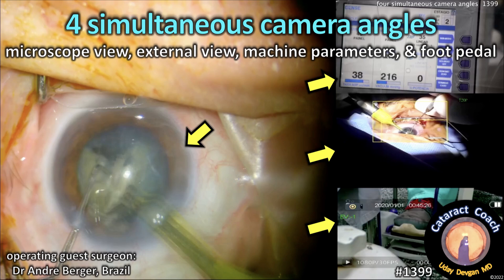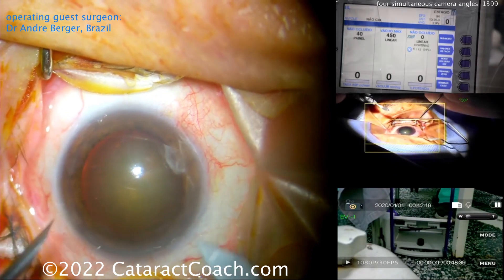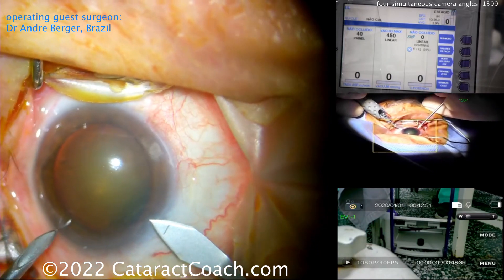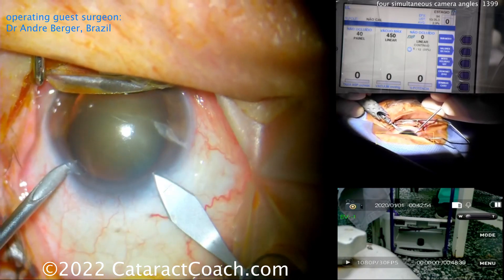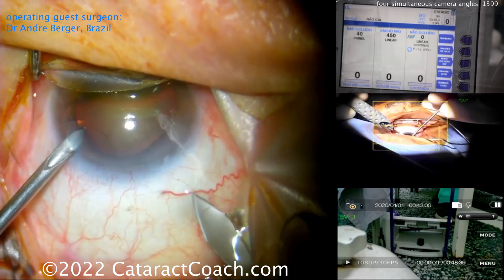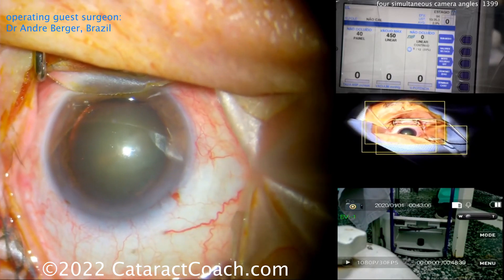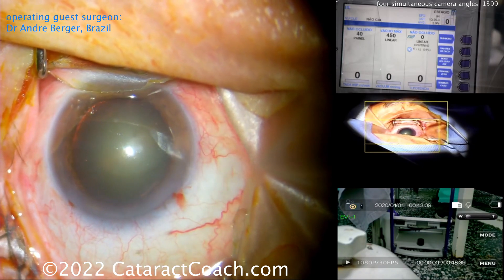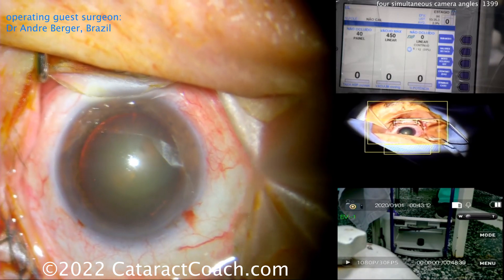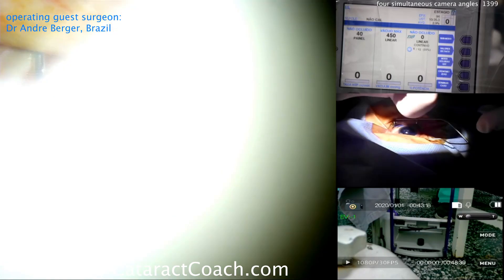cataractcoach.com — four simultaneous camera angles: the microscope view, an external view, the machine parameters, and even the foot pedal. Listen carefully — we even have audio now. Our operating guest surgeon is Dr. Andre Berger from Brazil, so the audio is in Portuguese. You can see him starting off the case using a double-blade technique, and we'll be able to see all four views at the same time.